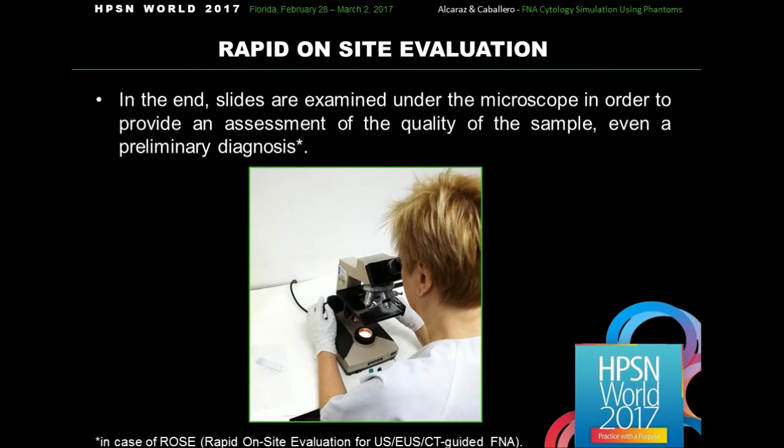Then we can assess the quality of the sample and even provide an approach to the diagnosis of the lesion under the microscope. A pathologist is necessary to diagnose and is the one who makes an interpretation of what he sees. This is not an analysis made by a machine. This is not a blood test. The decision and the report of the pathologist can radically change the life of a patient, using words like cancer or metastasis.